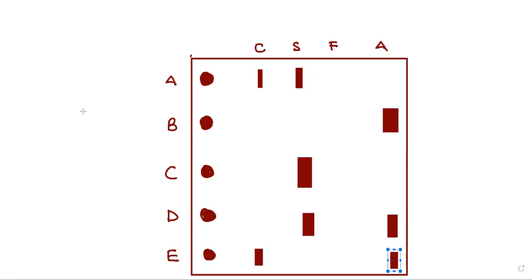So this is how the HB electrophoresis results may be presented to you. Then you are asked, what do you think? So Ofosua, let's begin with you. Which of the patients, identify the patients who have sickle cell disease?